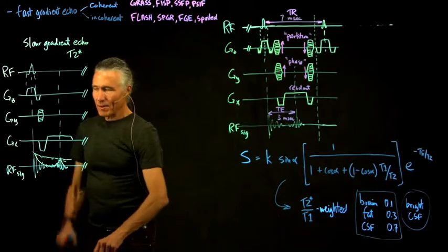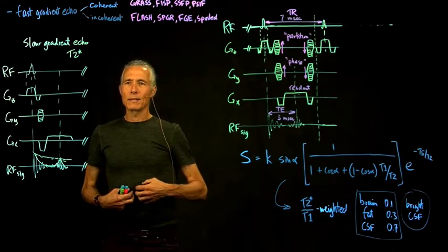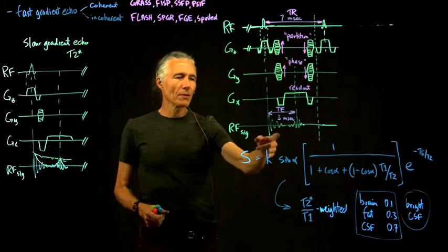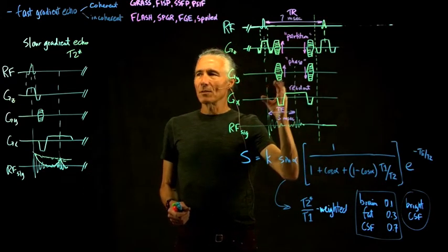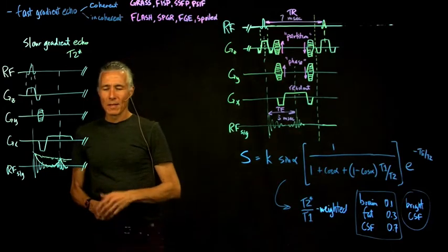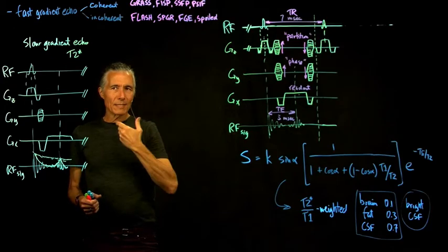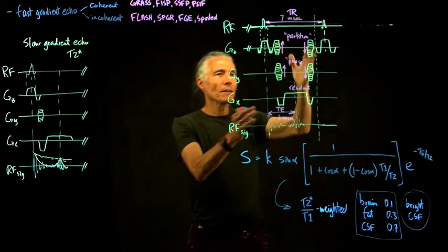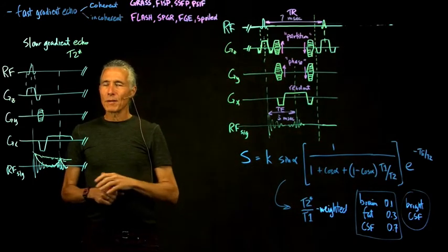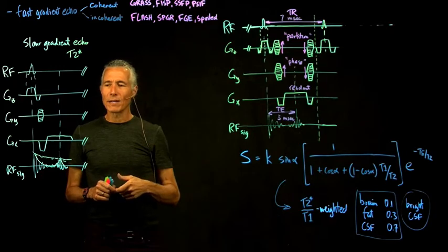One of the things that they were designed originally for was heart imaging, because there's a lot of fluid in the heart, and so you can really visualize that fluid quite well, and if you do a 2D sequence, you can do these very quickly. When I was in London, I did some imaging of the tongue with this. So if you just take one slice and then turn all the things down as short as possible, you can easily get up to about 10 images per second. And if you fiddle, you can get up more like 20 or 30 images per second.